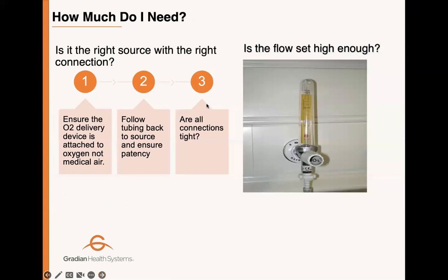So how much do you need? Ensure the oxygen delivery device is attached to oxygen, not to medical air. Follow the tubing to the source. Are the connections tight? Is the flow set high enough to give me enough FiO2 and good saturations? Next slide.